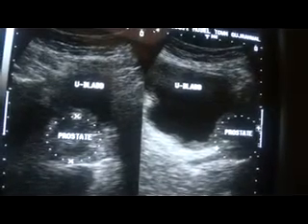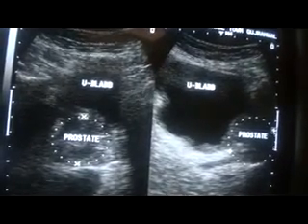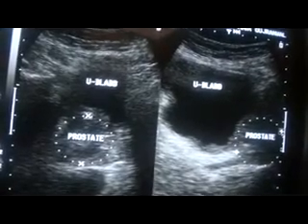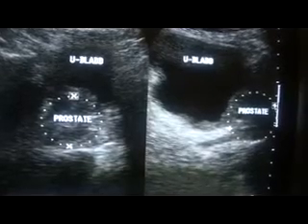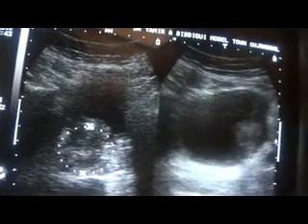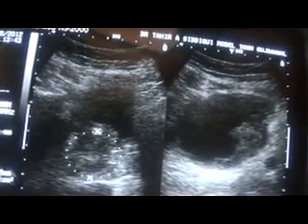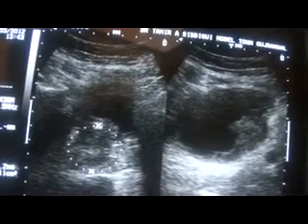We are trying to find the urinary bladder or determine if it is a prostatic mass. The prostate gland is seen free of any connection with the echogenicity within the urinary bladder. These are the echogenicities within the urinary bladder; the posterior wall is clearly seen. This is in fact a clot formation. If we can rule out other possibilities and renal causes, these areas will be considered as such. A differential of transitional cell carcinoma is noted however.